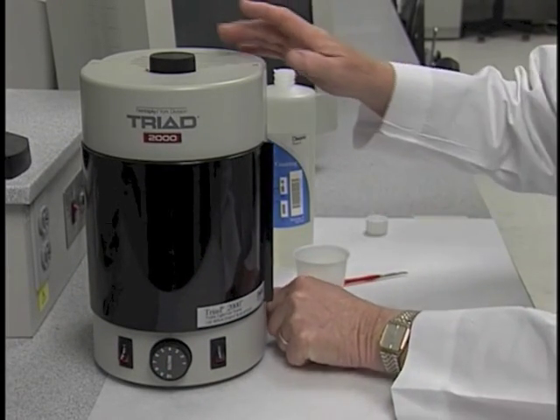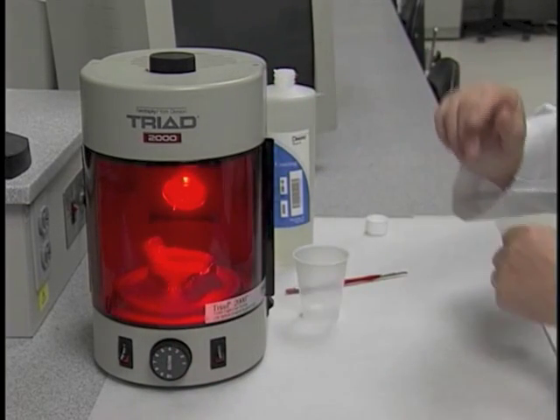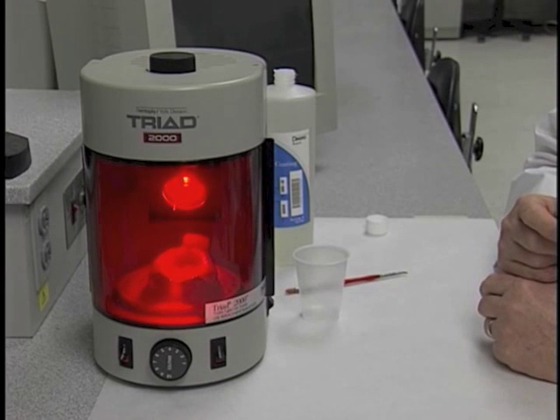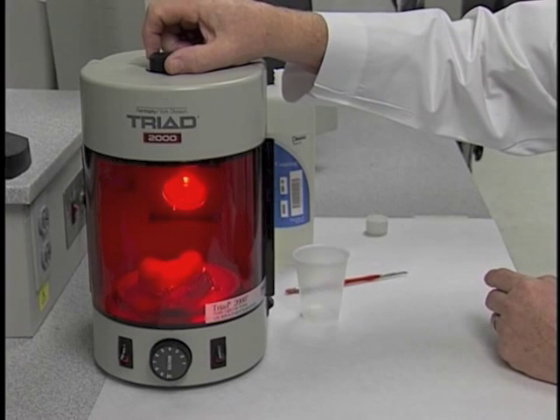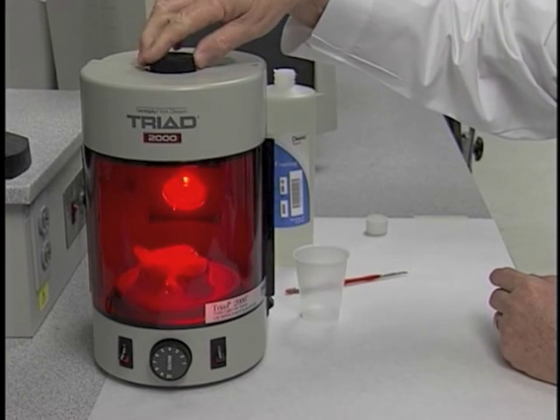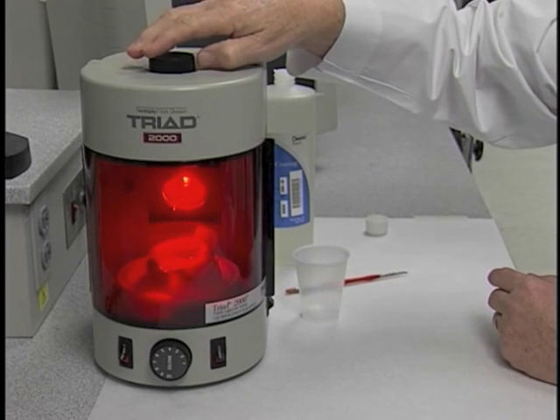Turn the oven on and allow that to cure for 4 minutes. Sometimes you may want to raise the table just a little to get a little better concentration of the light onto the object you're curing.